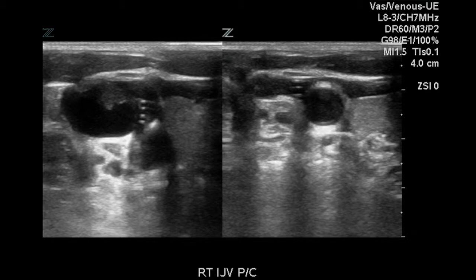This is an ultrasound examination of the jugular vein, subclavian vein, and innominate vein on both the right and left sides.